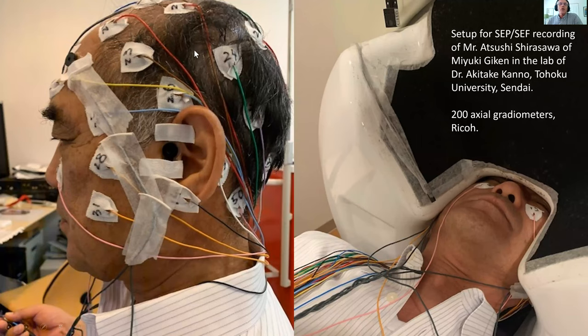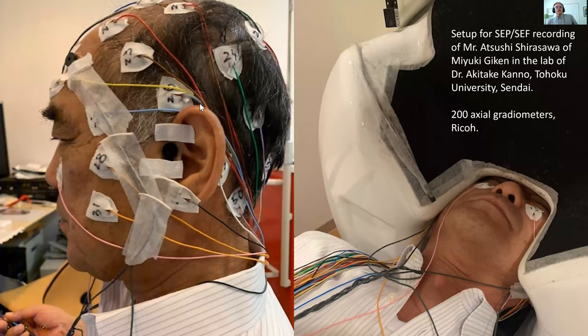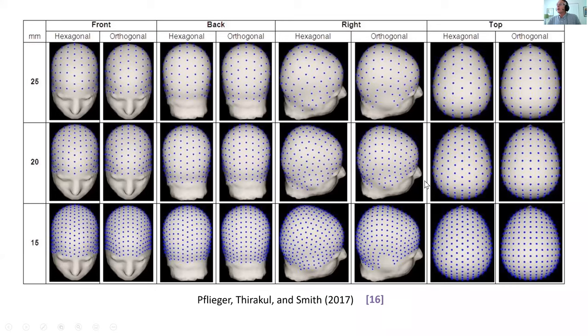Although most of the rest of the world has access to EEG, it's a lot messier. And so it takes more time either to put them on like this or to have a cap that would have a spacing like this. So the point of this slide here is that really it needs to be studied. If you have a region of interest that you're targeting, you might not need all of these. You might be able to design a layout based on the theory that tells you where to put the EEG electrodes, a small number that would be optimally placed for targeting certain brain regions of interest. That's why the theory and the modeling could be really helpful here. If you don't have the theory and modeling and you're just wanting to cover the whole head as much as possible, then you put something everywhere. I don't know if that got at your question or not.